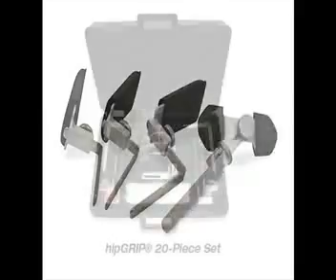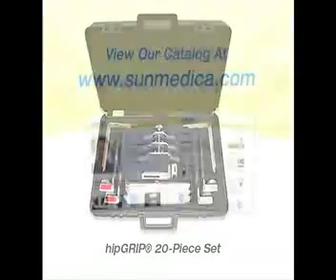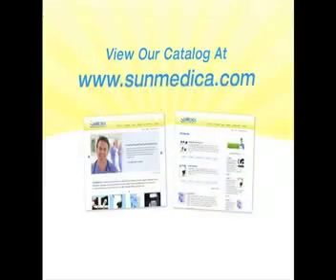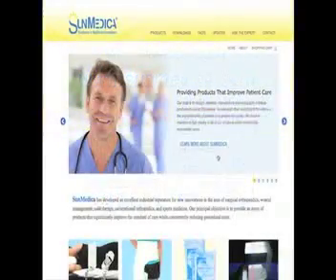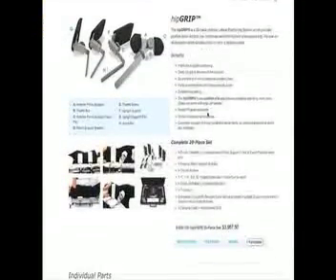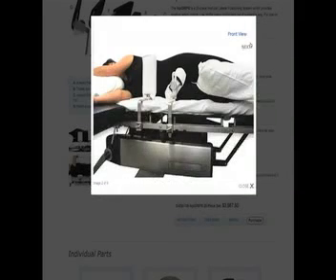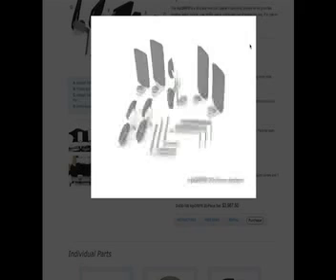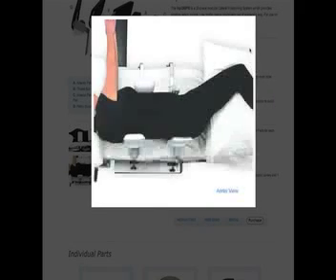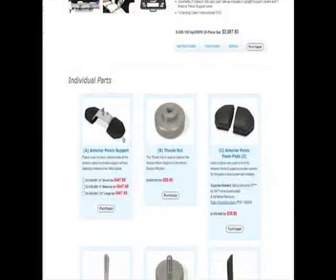For very long surgeries, release the pressure on the flat posterior pelvis support for 20 minutes, then re-tighten. After use, discard the covers, clean per hospital procedures, and store the Hip Grip in the case provided. This is a well-designed quality system, and the well-cared-for Hip Grip will last many years. Replacement parts are available through Sun Medica.